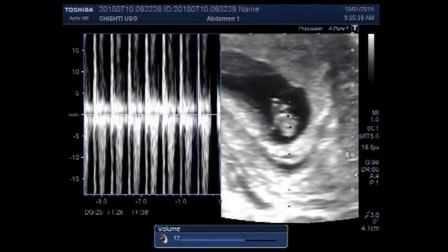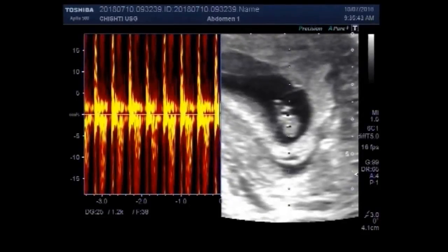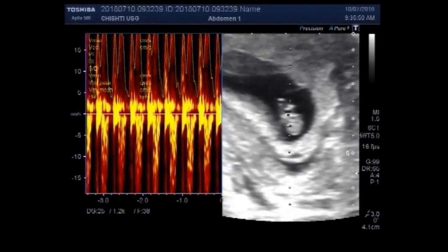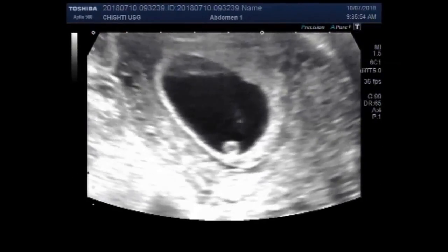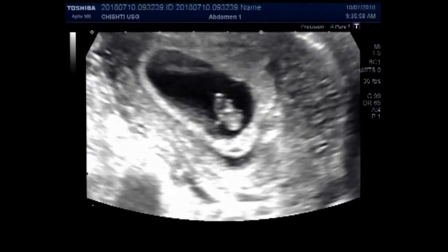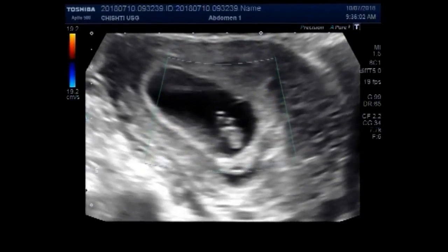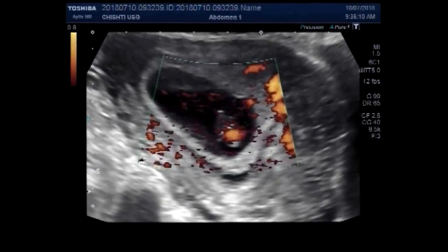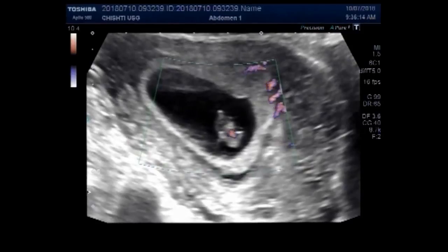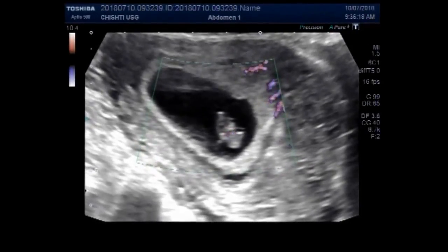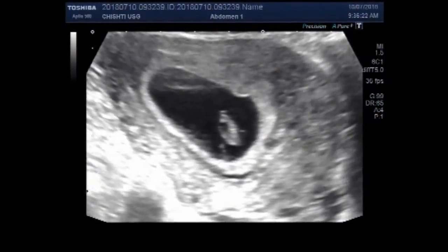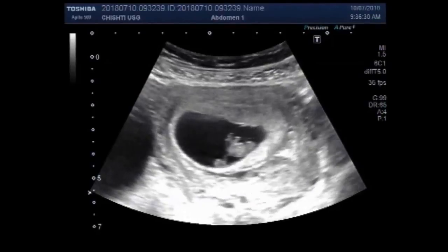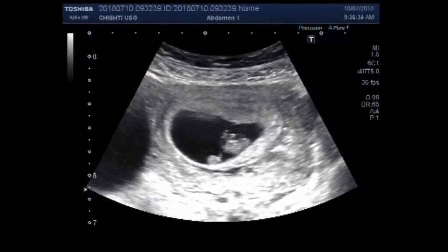You can see the fetal cardiac activity. You can see the blood flow inside the fetal heart. Fetal cardiac activity is clearly visible.